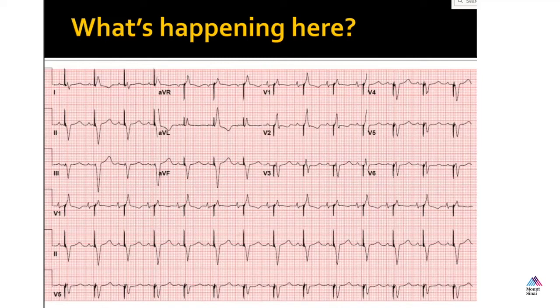And then typically after a defined period of time, like 30 seconds or 60 seconds, if it detects that conduction is occurring, it will actually revert back to an AAI. And the goal of that approach would be to basically pace the ventricle as little as possible, which is probably better physiologically and certainly saves battery life. But as I've explained to you in the past, sometimes that's hard to do.